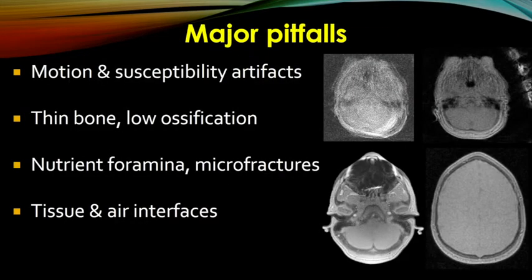To conclude from our clinical cases, major pitfalls for interpretation are going to be MRI artifacts. So even though ZTE is pretty artifact resistant, it still takes a couple minutes, and if the patient's really on the move during that time, the results can be pretty ugly. Here, though, is the same patient after feed and swaddle and being held by the tech, so you can see the results are a lot better. And remember, for infants, you don't have to have perfect imaging, but just being able to assess head shape and interrogate the sutures of interest is still really helpful.